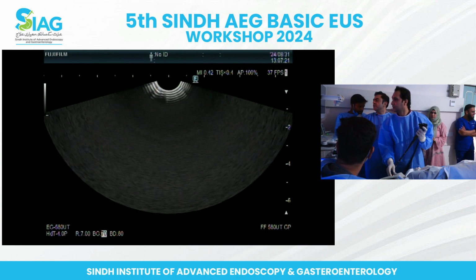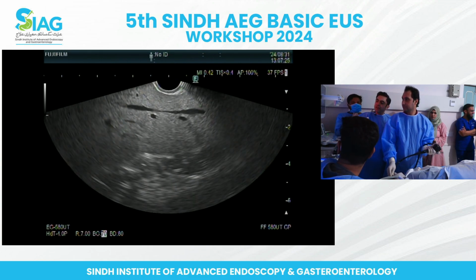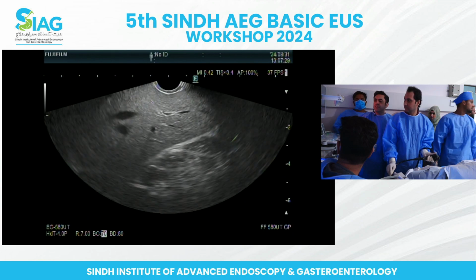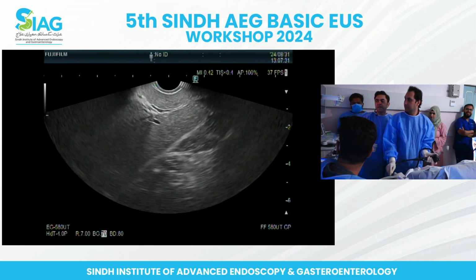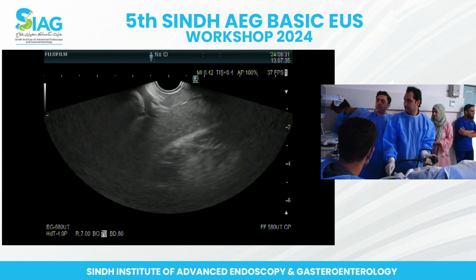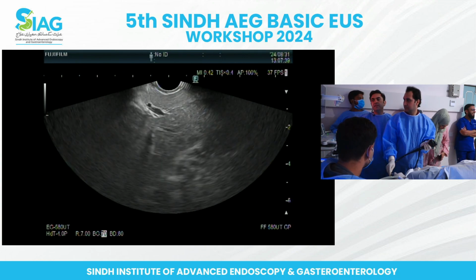So it's like the ERCP. Yeah, excellent. I think you're in the bulb now. So keep it on the left. Yes, excellent. The top left, and you can see the liver structures. Now do a slight clockwise. Keep on turning clockwise until your aim is to find the portal vein.